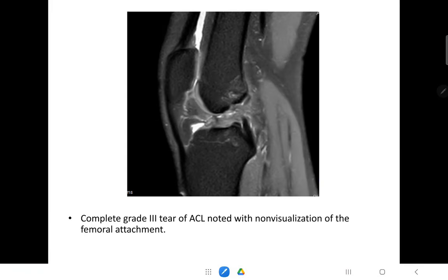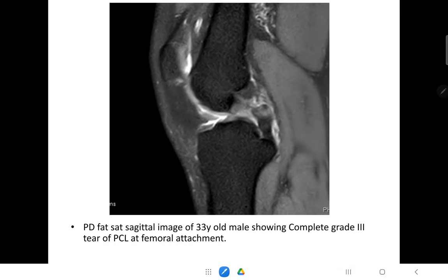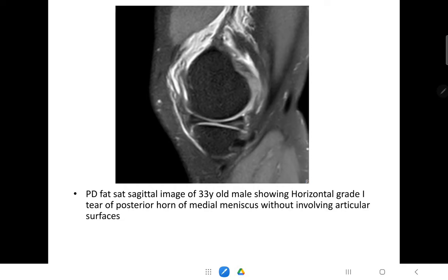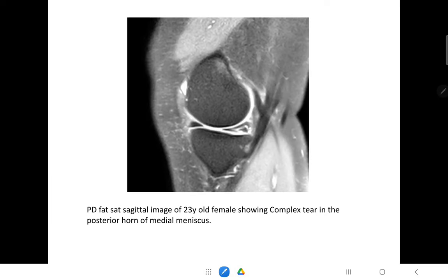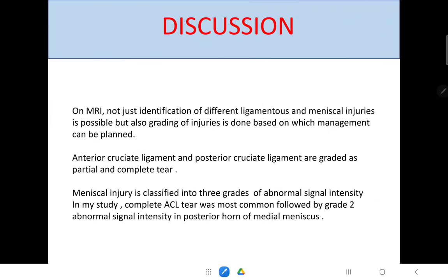These are the images of the patients. This PD-FATSAT image shows a complete grade 3 tear of ACL with non-visualization of the femoral attachment. Another PD-FATSAT sagittal image of a 33-year-old male patient shows a complete grade 3 tear of PCL at the femoral attachment. This image shows a horizontal grade 1 tear of the medial meniscus in its posterior horn without involving articular surfaces. There is also a complex tear in the posterior horn of the medial meniscus.